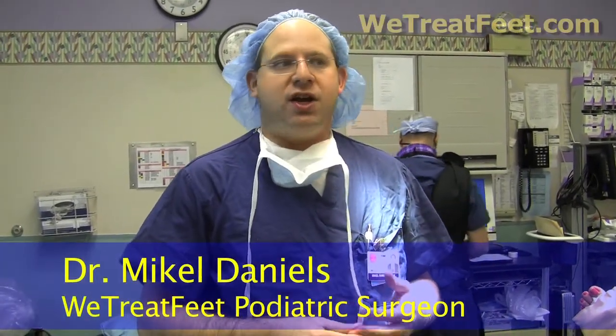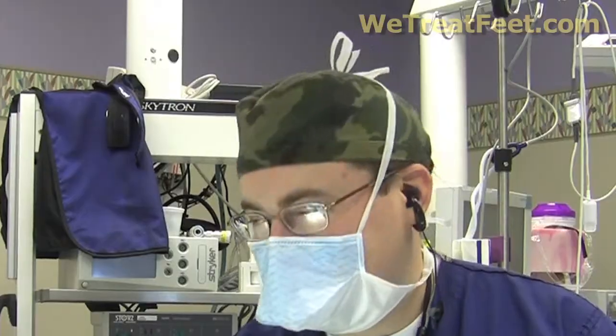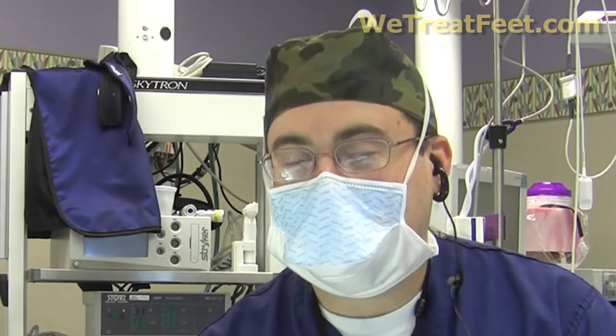It reduces the necessity for narcotics, which reduces complication rates such as dizziness, sleepiness or somnolence, and constipation. I've had several people who come in for multiple procedures, one foot and then the next foot. The first foot, they don't have it, they want it the second time. And every patient that's had it the first time definitely wants it again the second time. The majority of patients say they'd rather have a numb foot versus a painful foot.